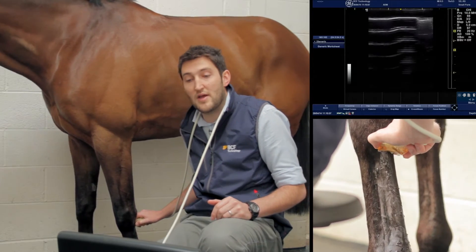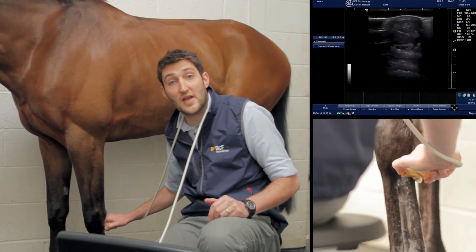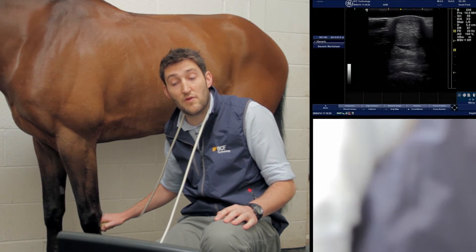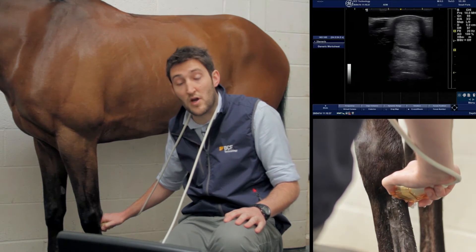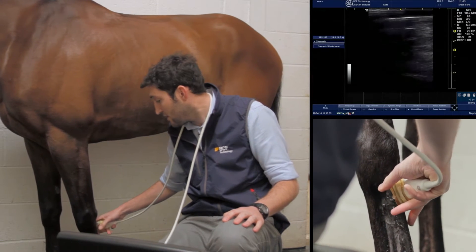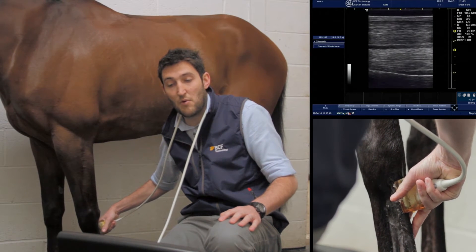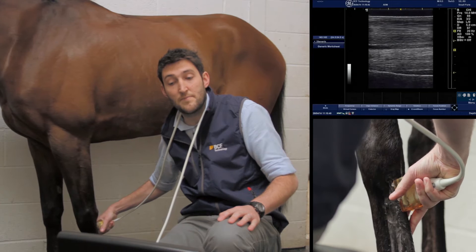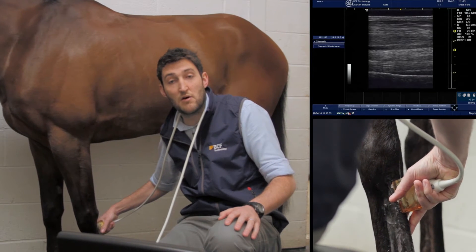So we were up here in zone 1A. We're just going to rotate our probe — bearing in mind what I said earlier about keeping lateral to the left of the screen — we're also going to keep proximal to the left when doing the longitudinal section images. All we need to do is rotate our probe 90 degrees clockwise so we've got our marker at the top of the leg, and then we get our longitudinal image, aiming to get all those fibres lined up roughly horizontally on the screen and as best we can through the midline of the tendon.